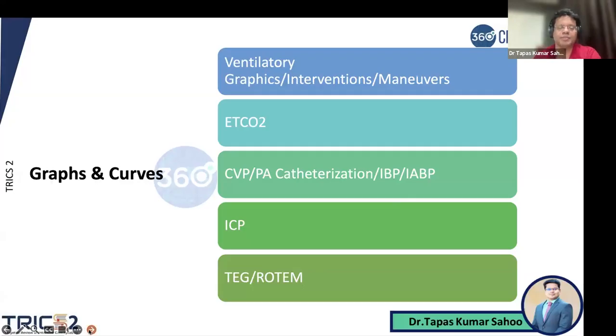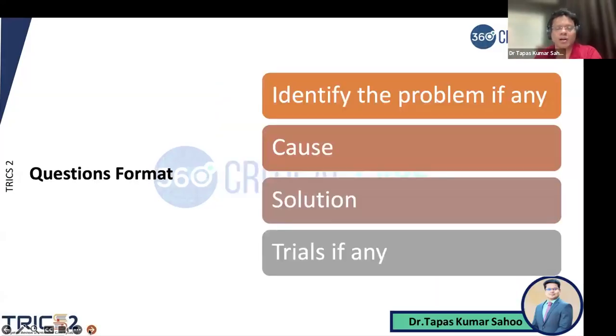15 to 20 minutes. Now, the question format related to ventilator graphics or any of the graphs and curves would be revolving around four question patterns: identify the problem, cause, solution, trials, if any. Okay, so right now, these are something which you need to understand.